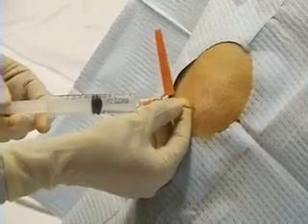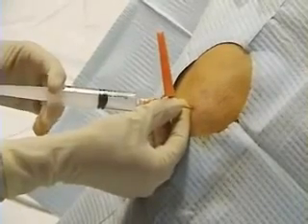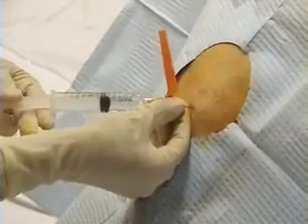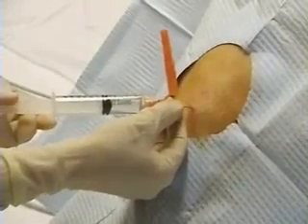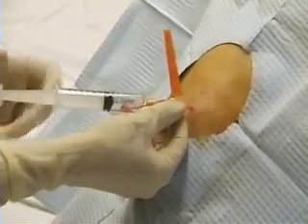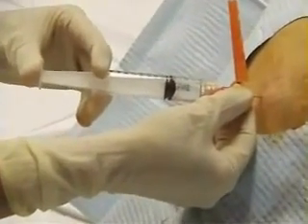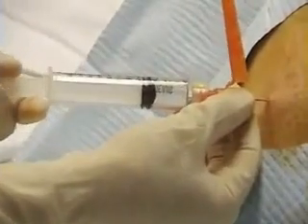The inferior surface of the rib must be avoided since the intercostal vessels and nerve are located in this region. At this point, walk the needle over the superior aspect of the rib, alternately injecting anesthetic and pulling back on the plunger as you advance. Once the needle enters the pleural space, pleural fluid will begin to fill the syringe. Inject more anesthetic at this point to anesthetize the highly sensitive parietal pleura.